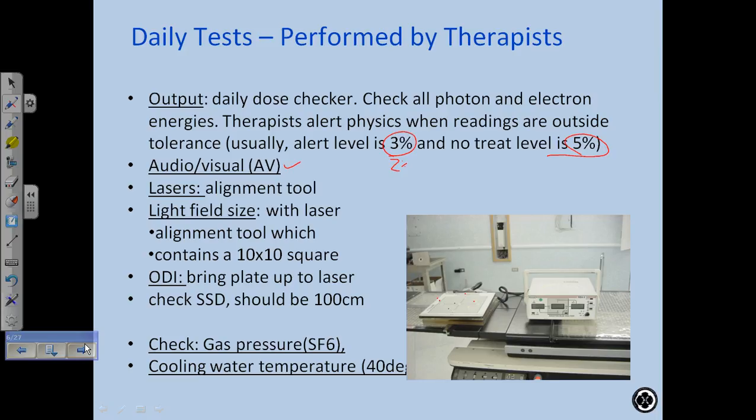You would need to call the engineer, right? Yeah. First of all, you can't treat. Okay, so you need to know that it's a regulation that you can't treat. So this is where you guys need to know the line where you can say treat or don't treat, okay? And that can get us into trouble sometimes, because if you don't know that line, you say don't treat, and they can actually treat, and you can get into a little bit of trouble. So you need to know where the line is where you can say don't treat.